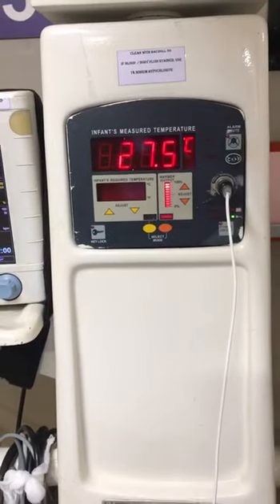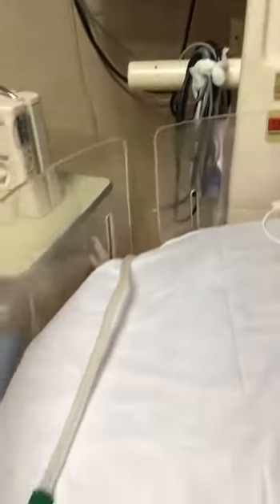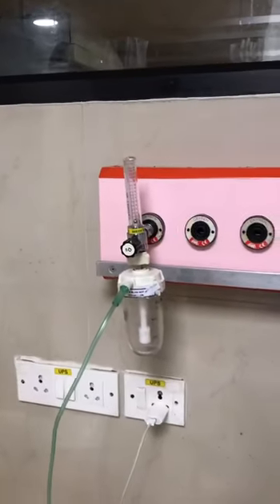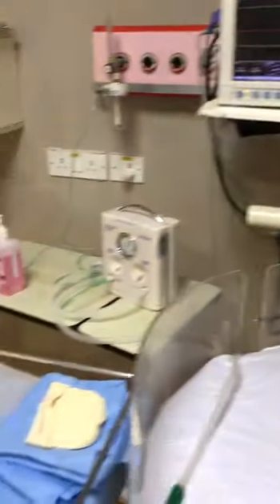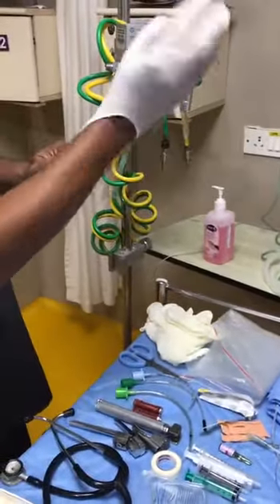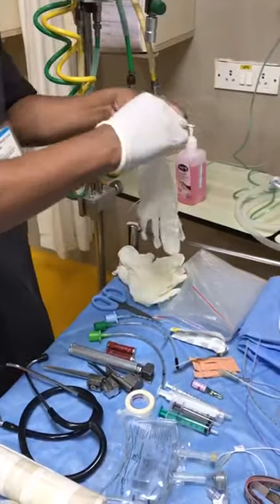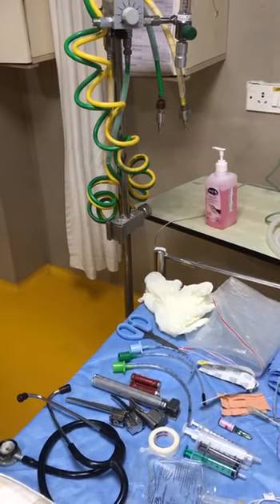Suction apparatus, can you please check the suction apparatus? Is it working or not? Yes, it's working. So oxygen source, hope it is there. Yes, oxygen source is there, connected. So now I'll wear the gloves. Can all of you please wear the gloves? We already washed the hands, just wearing the gloves.